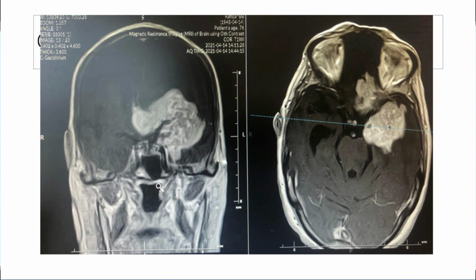What else? So that is one of the three I know. What else do we look for? Edema can give us the idea. What else? Where there is a tumor and the tumor is proliferating fast, it needs food, and the food comes through blood vessels. Post-contrast enhancement. Okay. What else? You need the engorgement of the blood vessels in the locality. Okay. So you do see that. And there you go.